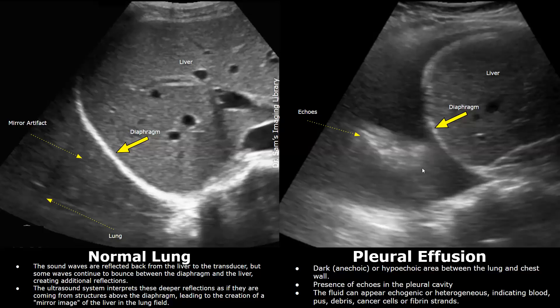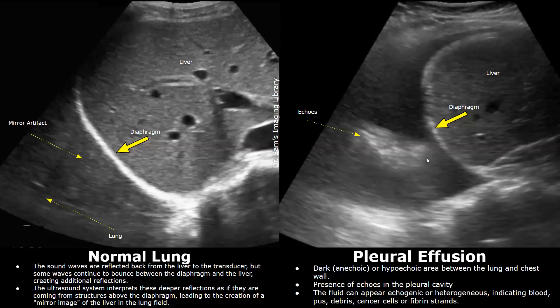In some cases of pleural effusion you may see medium-level echoes or hyperechoic areas inside the pleural cavity. There is hypoechoic fluid above the diaphragm and also medium-level and hyperechoic areas. These echoes may indicate blood, debris, cancer cells, or fibrin strands. This area has a heterogeneous appearance.